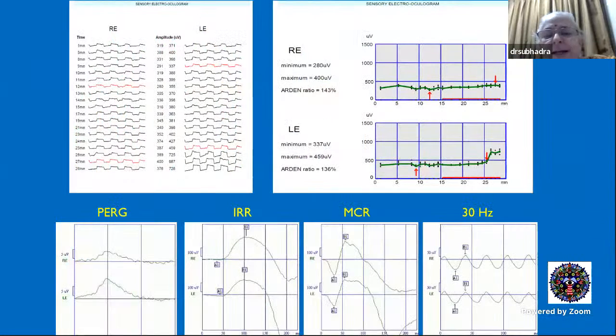And you can see here why this patient has good vision, because his pattern ERG is very good. So that fluid which you're seeing on OCT is not actually a fluid where you have to do an FFA and find out the CNVM. This is actually the lipofuscin deposits, which are giving the appearance of fluid. And I have seen people injecting these eyes thinking that there is a CNVM and fluid. So this is where the importance of electrophysiology or just a proper clinical understanding of the disease comes in, that the photoreceptors are healthy. It is an RPE disease.